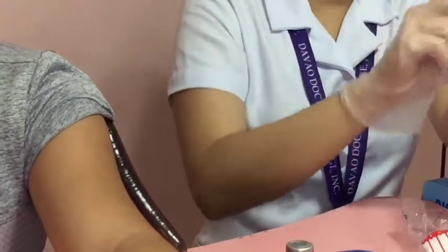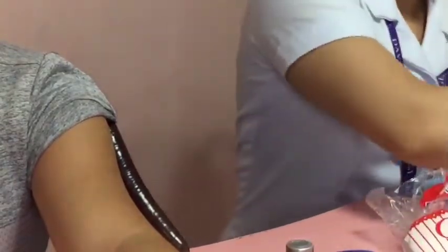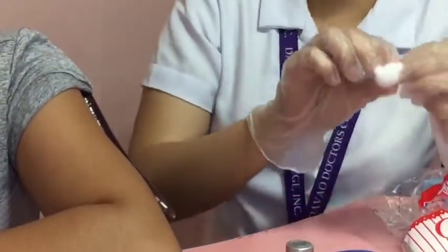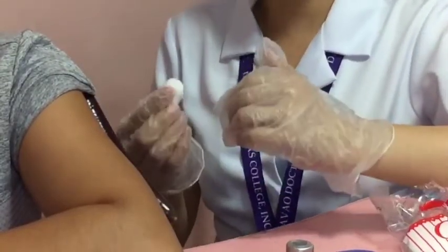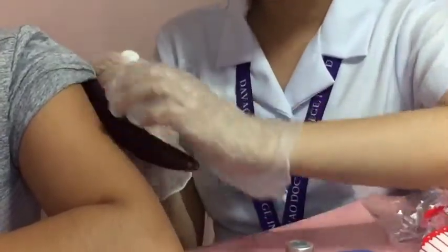So now, as agency protocol indicates, clean the site with an antiseptic swab. Start at the center of the site and clean it in a widening circle for about 5 cm or 2 inches. Allow the area to dry thoroughly. The mechanical action can remove the skin secretion which contains microorganisms. So ma'am, maglilinis ako ma'am ha.